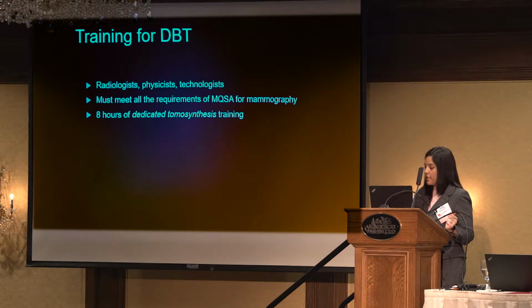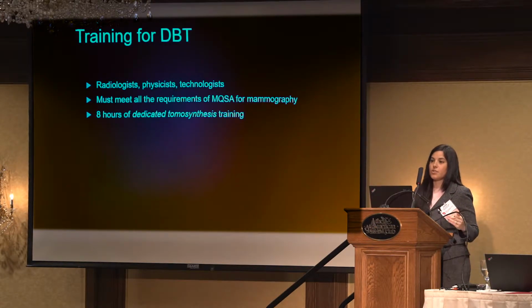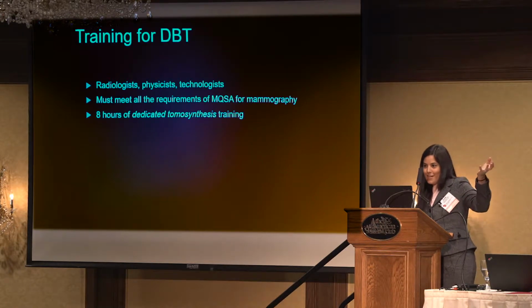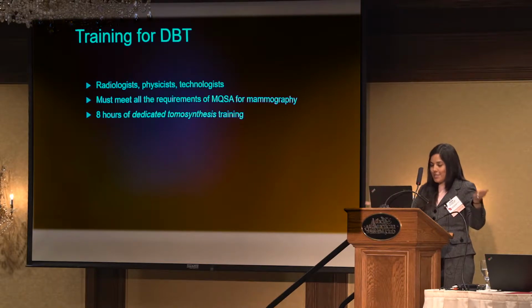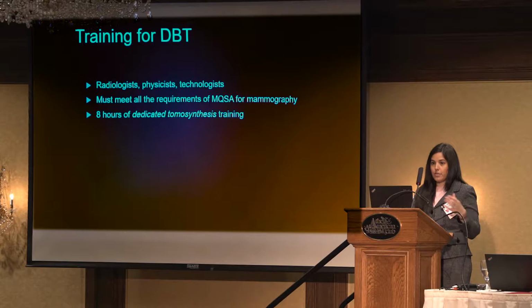In addition to meeting the MQSA mammo requirements, all personnel must receive 8 hours of dedicated tomosynthesis training prior to clinical implementation. This used to be dedicated vendor specific. So when we had our trial, we had to do 8 hours of one vendor and then an additional 4 hours of the other vendor. But the FDA has since revised that and said training in one or generic training for DBT will suffice. Residents and fellows can get this 8 hours during their training as long as it's documented in a letter by their program director.